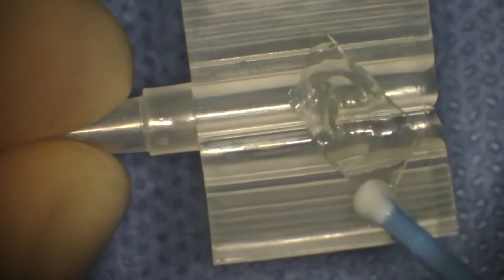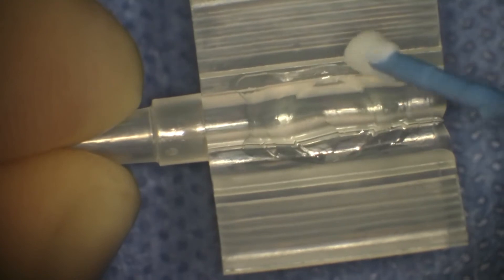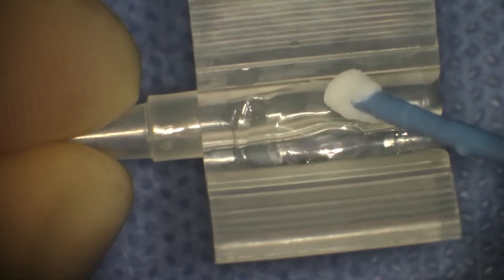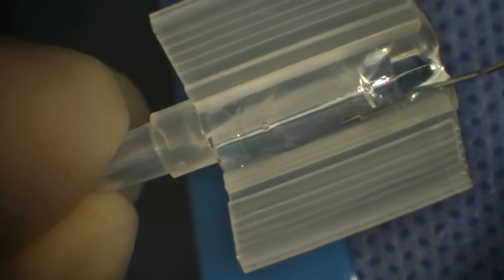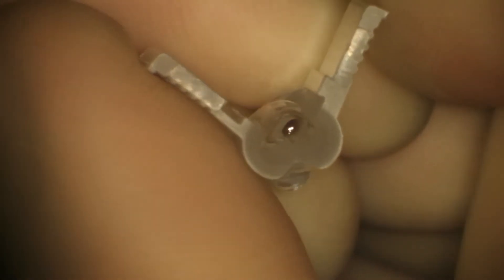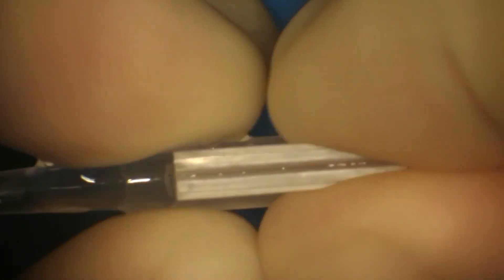Folding is simple. The ICL is brought onto the platform — the folding platform — and tucked underneath. There are two ridges; you need to tuck it underneath. No additional instruments are needed to fold the lens. Initially I don't lubricate the cartridge because it's easier to get the lens folded in there, and then afterwards I fill with BSS to try to get any air out. You can directly visualize the ICL while you're folding the wings together and snapping them.